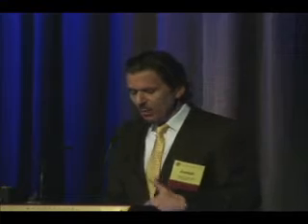Loss of the disc rim. We can look at rates now with quantitative imaging, and we have these three techniques, of course. Most of what I'm going to talk about has to do with HRT and confocal scanning laser ophthalmoscopy, where the techniques for developing measurements of progression are probably most well developed.